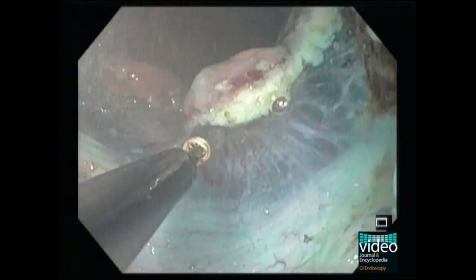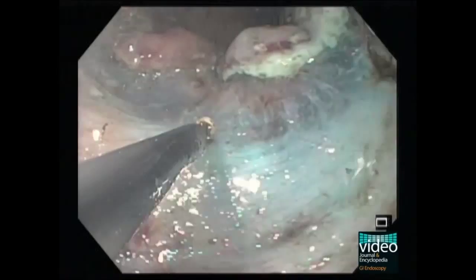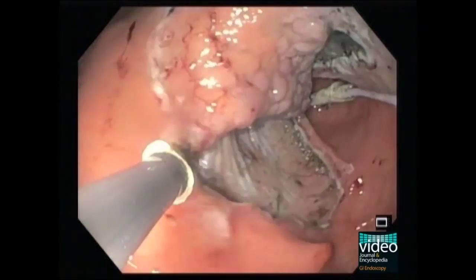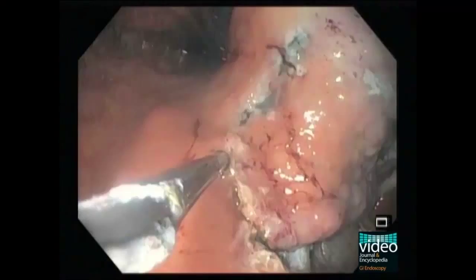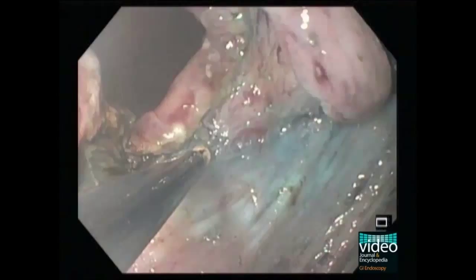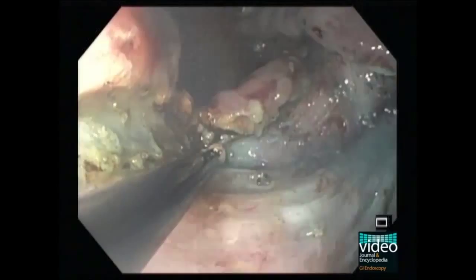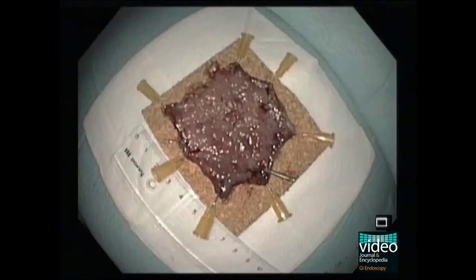The advantages of this technique are highlighted in this case, where a retroflexion position is needed and access to the submucosal space and luminal side is hampered. With the yo-yo, the full mobilization of the lesion enables fewer and more precise maneuvers of the endoscope and knife.